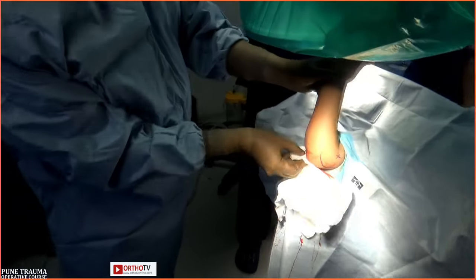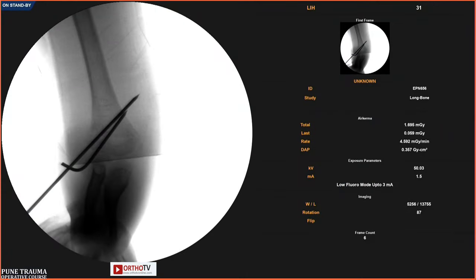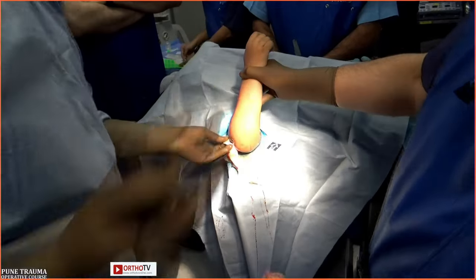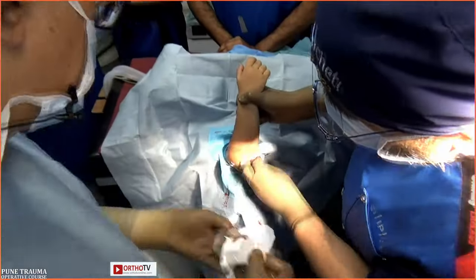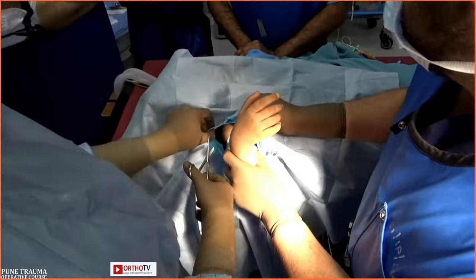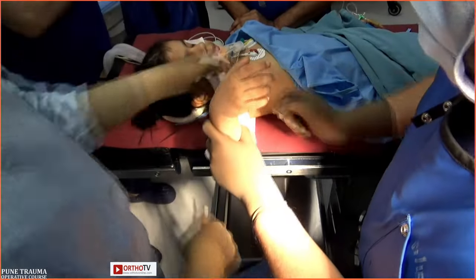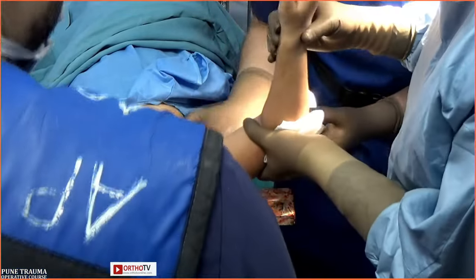Ajit. Yeah. This is one of the areas where we tend to have multiple passes because the entry may not be satisfactory or the direction may not be satisfactory. Like in other areas, like you were discussing yesterday, are there papers or reports of physeal damage due to that? Yeah. So you have to minimize the passage of K-wire for two reasons. Because you want to avoid damage to the lateral condyle physis. Second, if you pass multiple wires, these wires are initially going through the cartilage and then through the bone. If you make multiple punctures in the cartilage, your hold on the wire itself becomes very loose. And all of us have experienced that.